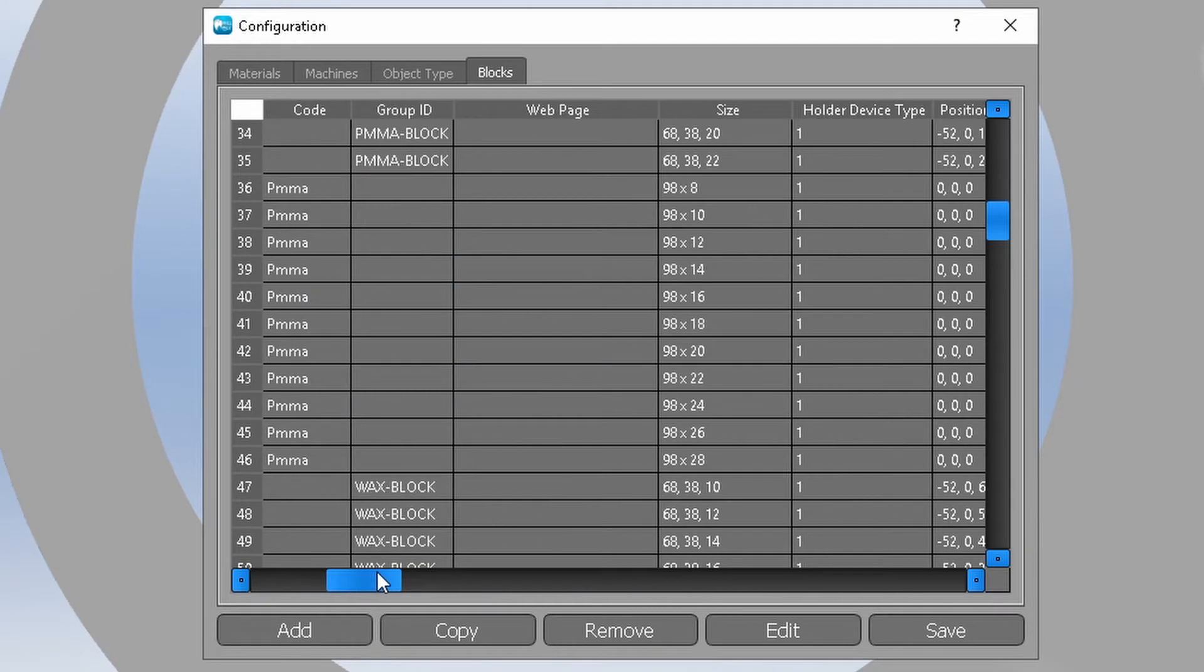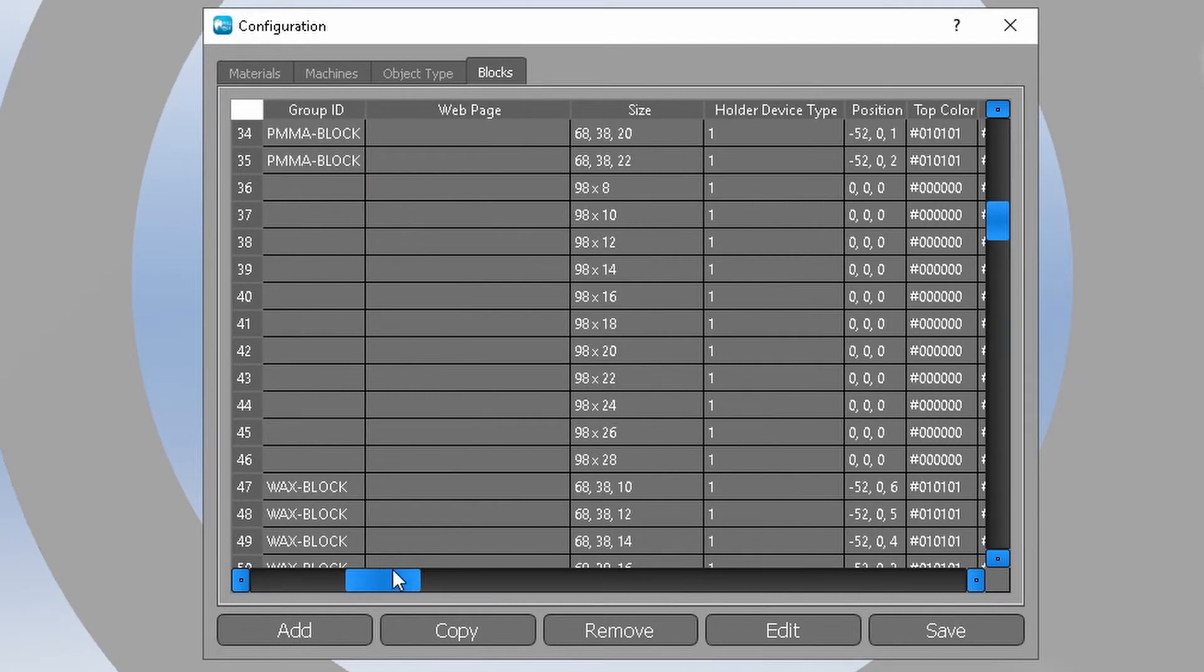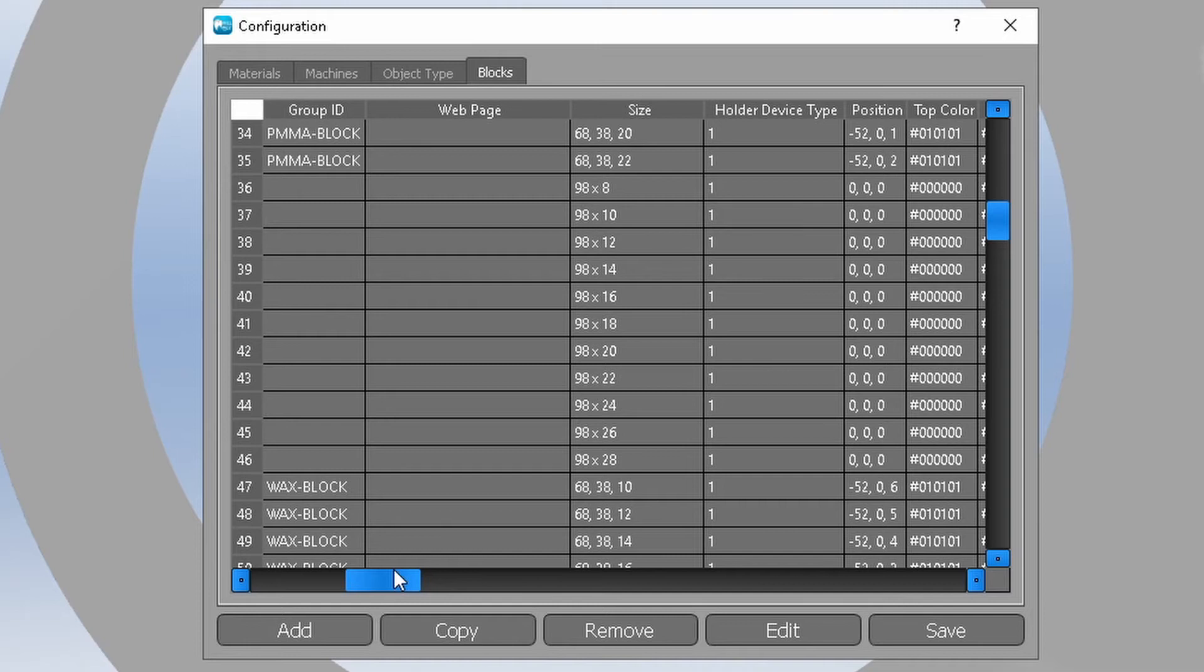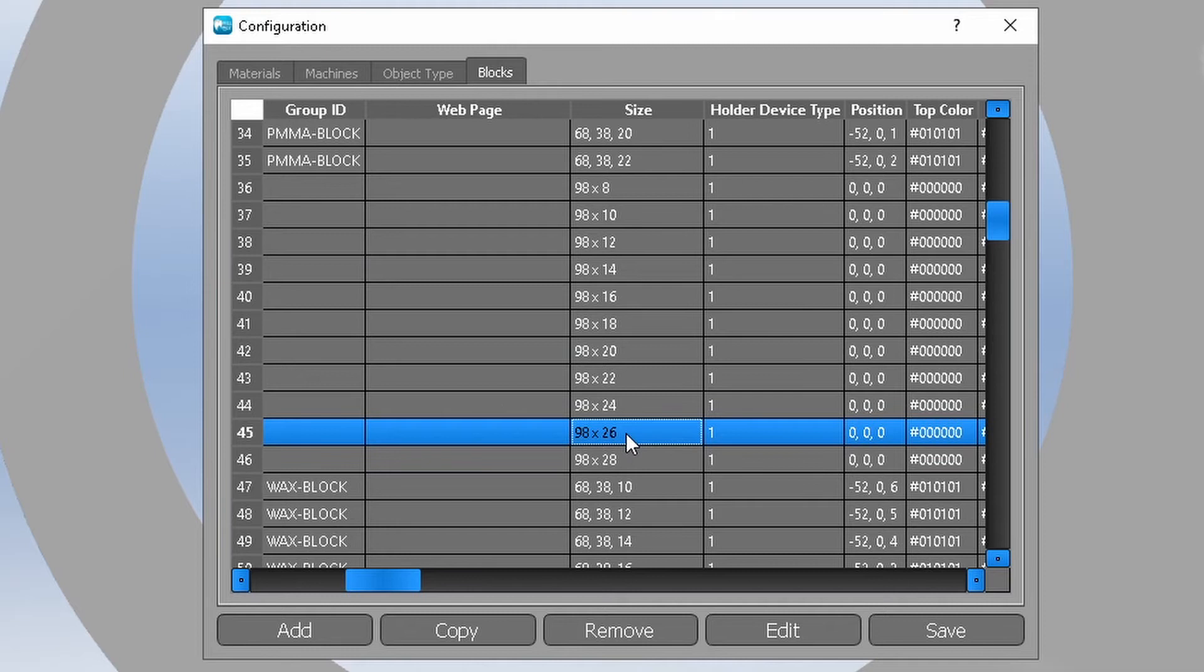If there is a blank size in the list which is never used, then we can edit it. If all sizes are in use then we can copy an existing one and adjust it to the desired size. For example, we never use 26mm PMMA blanks and we want to have 25mm instead.